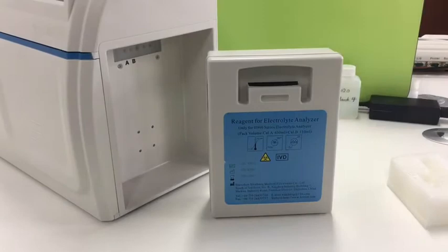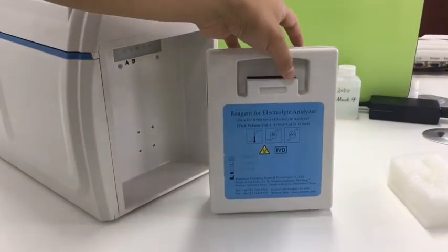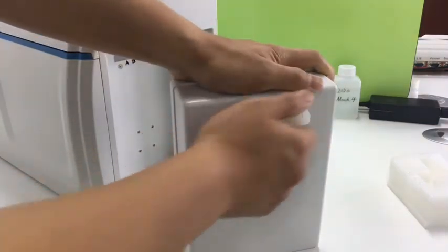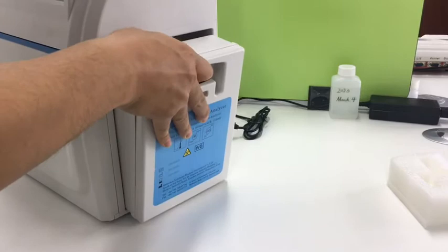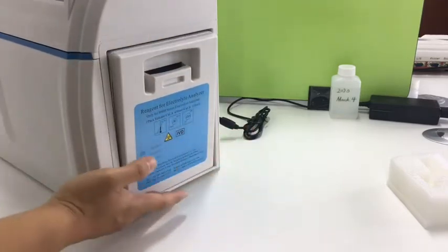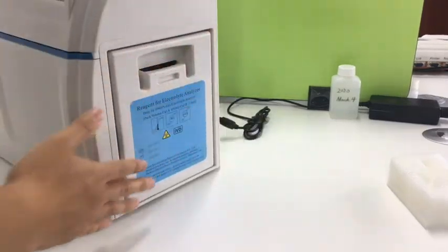Now let's install the reagent pack. We put it at the bottom in position, then push the head, and it is done.